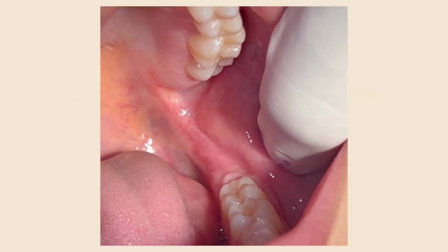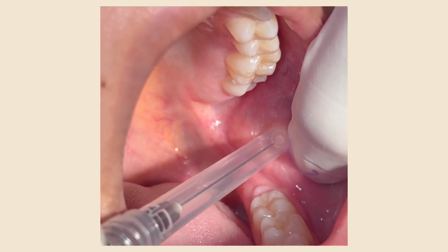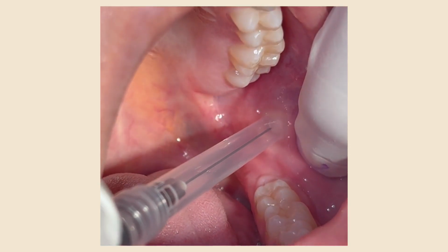What is the area of insertion? It is on the mucous membrane on the medial side of the mandibular ramus, at the intersection of two lines, one horizontal representing the height of needle insertion and the other vertical representing the anteroposterior plane of injection.